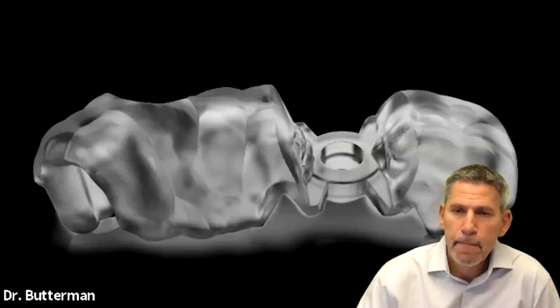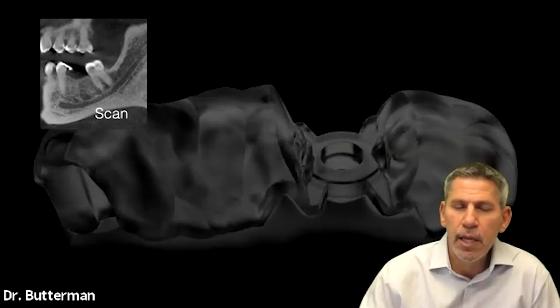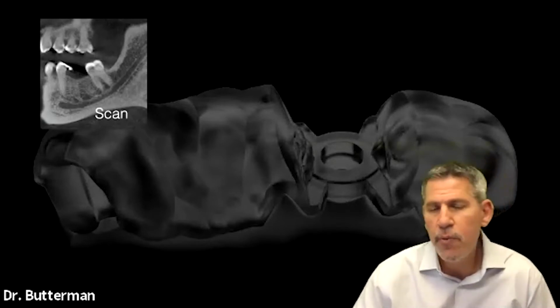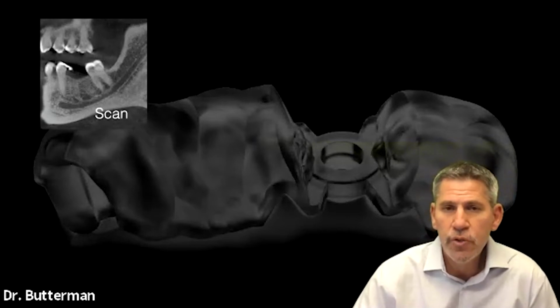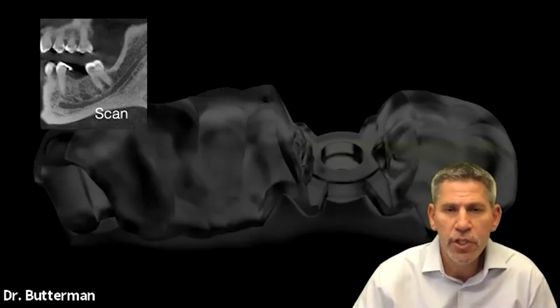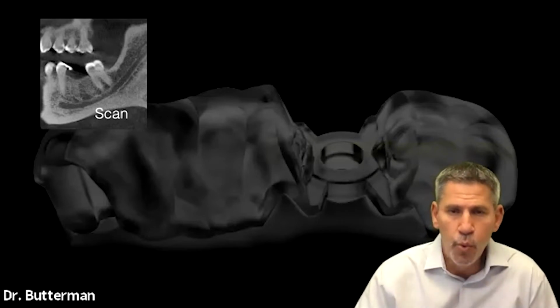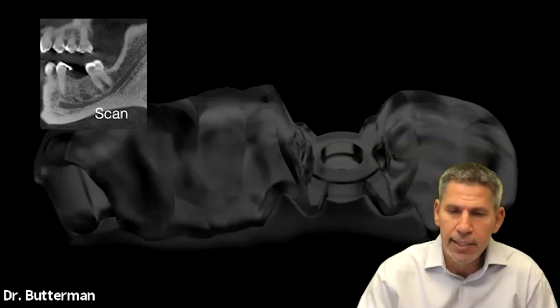If I have a patient that comes in and they're missing a molar, for example, I'm going to say, okay, let's talk about how we can potentially restore that. The first thing I'm going to do is take an Axeos scan, so that I understand the biology. What are we dealing with in three dimensions, so that there are no surprises?